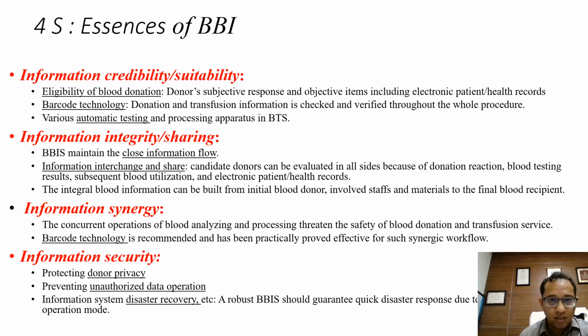So what are the essences of BBI? You can easily remember it through the 4S: information suitability, information sharing or integrity, information synergy, and information security. When I say suitability, or credibility, it is the eligibility of the blood donation, which can be improved if we have a more objective health record. We can use the barcode technology for it, and various automatic testing and processing apparatus can be used.